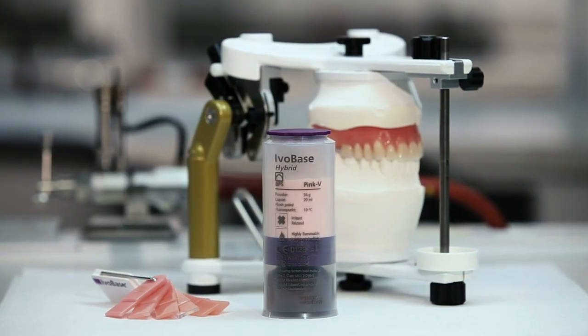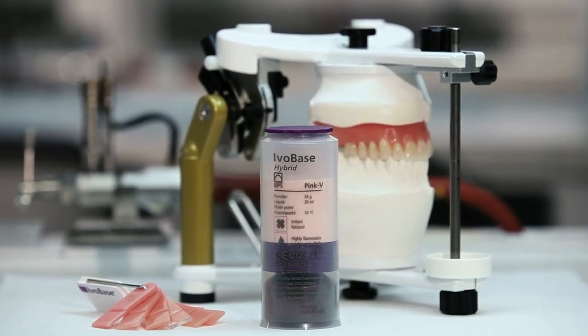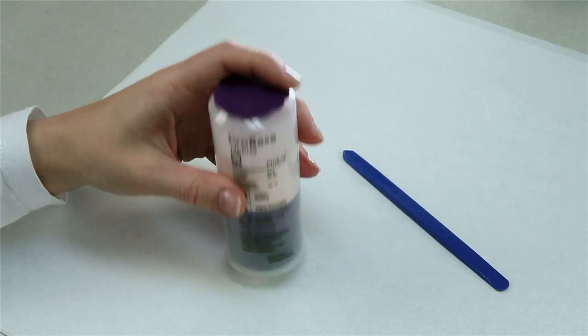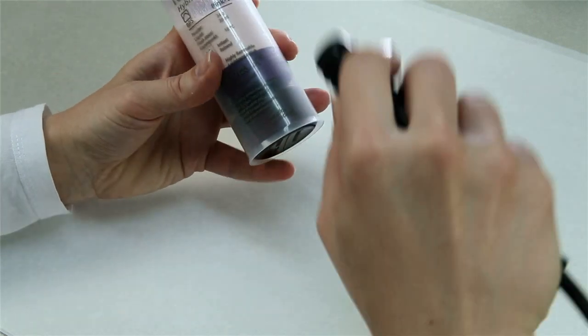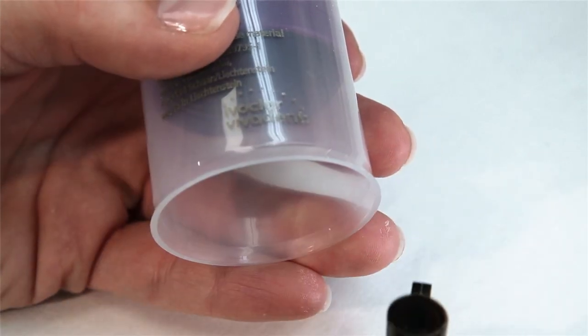One capsule is sufficient for the injection of a maxillary or mandibular complete denture. A short blast of compressed air between the monomer container and the capsule renders the monomer container easy to remove from the capsule.